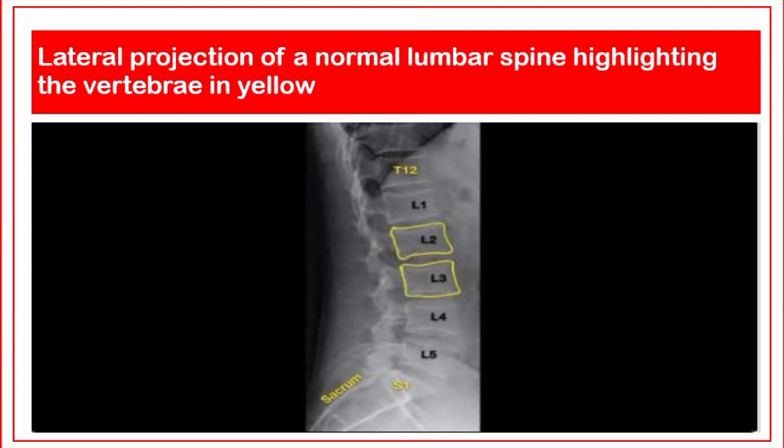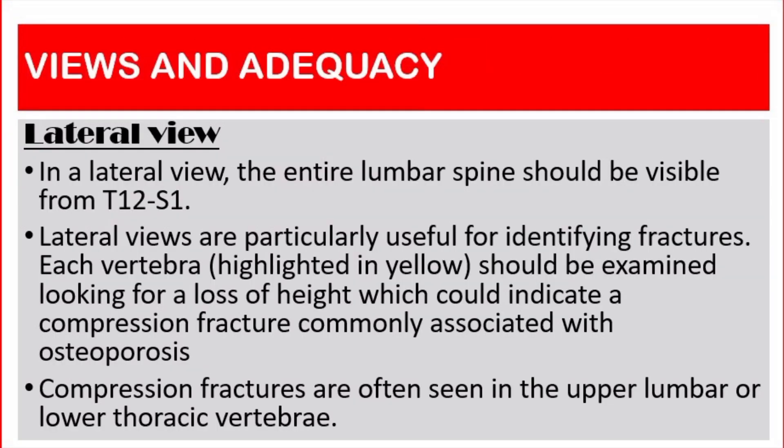In a lateral view, the entire lumbar spine should be visible from T12 to S1. Lateral views are particularly useful for identifying fractures. Each vertebra, highlighted in yellow, should be examined looking for a loss of height, which could indicate a compression fracture, commonly associated with osteoporosis. Compression fractures are often seen in the upper lumbar or lower thoracic vertebrae.